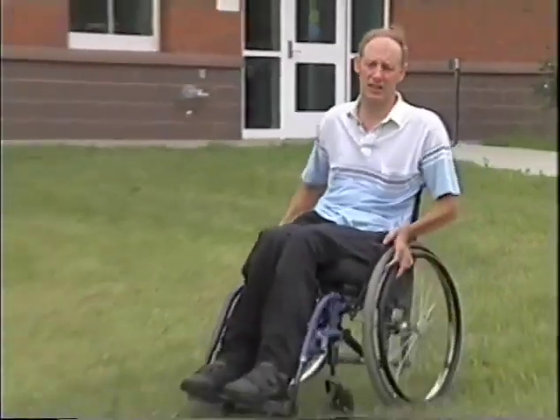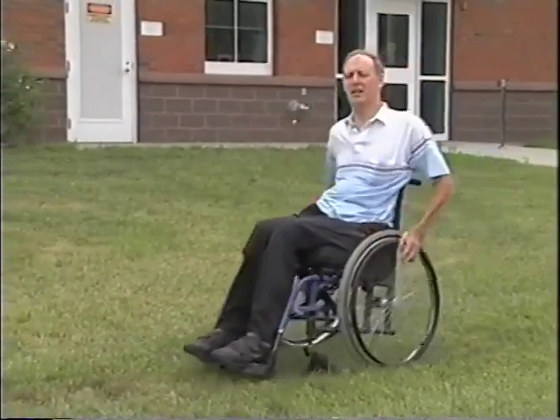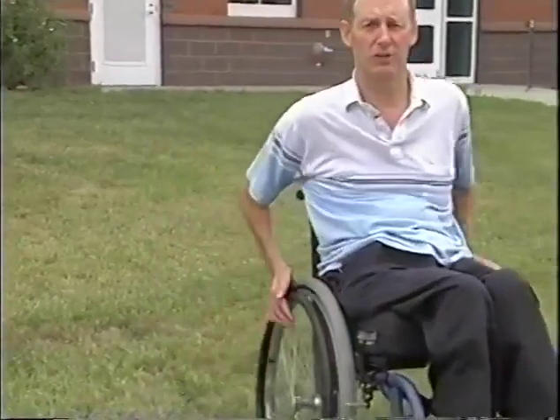When it comes time to wheeling on grass or soft surfaces such as sandy soils or carpeting, anything that is going to slow you down, one of the big tricks is to keep your weight on the back of the chair. You want the front wheels to be light and not falling in every little nook and cranny as they go along. So the main thing is just keep your weight back and you'll be fine for wheeling around on soft surfaces.